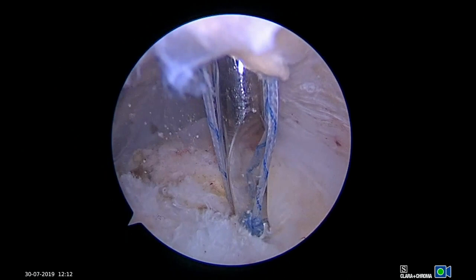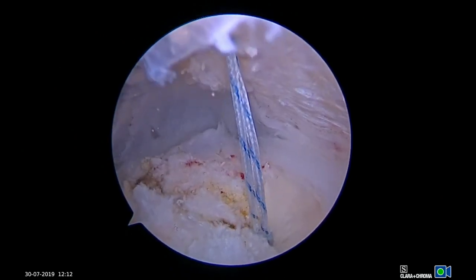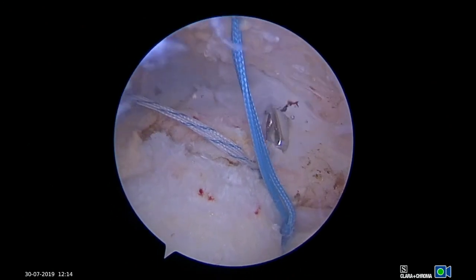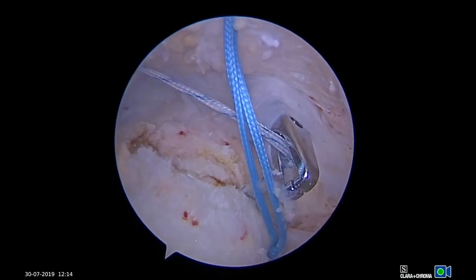The sutures are then tied using arthroscopic knot-tying techniques. Note that one knot stack is anterior to the bursal split and one knot stack is posterior to the bursal split.